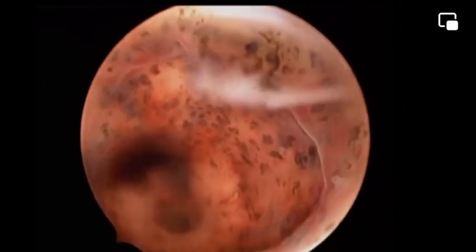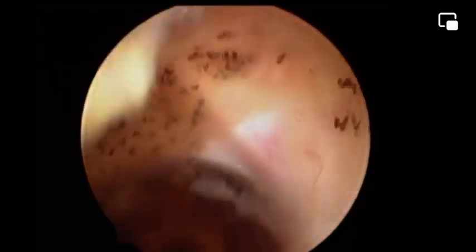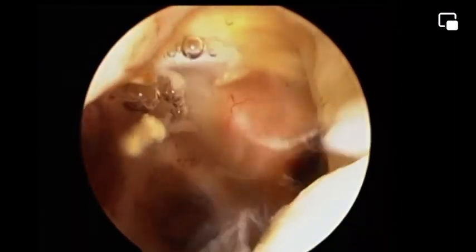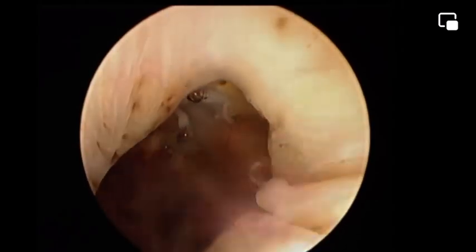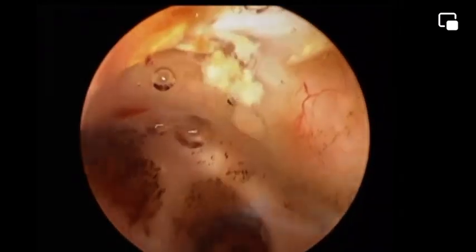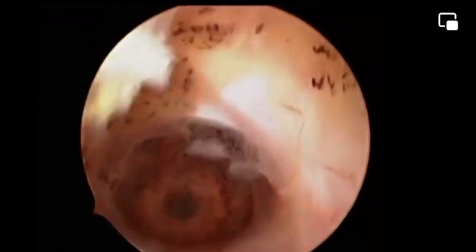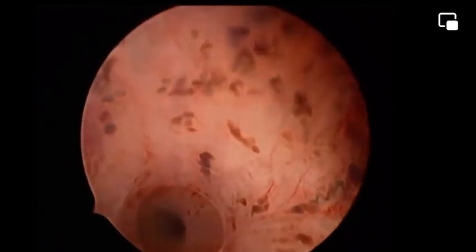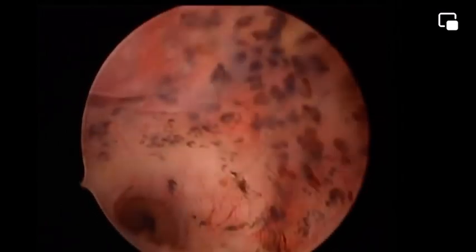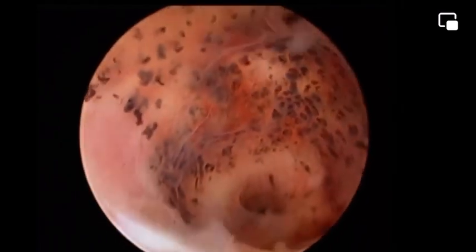And as I promised you, we will share together more pathology in this case. So after cleaning the mucus and the blood inside the cavity, and this is achieved by an intelligent, judicious use of the inflow, outflow. Hysteroscopic surgery is not like laparoscopy. In laparoscopy, you have inflow and the outflow is suction. But here, don't do suction. If you apply suction, the walls will collapse. I know that it is a common teaching to use suction to clean the cavity, but in my personal opinion, no. Just open the outflow and the negative flow of the fluid will clean the cavity.